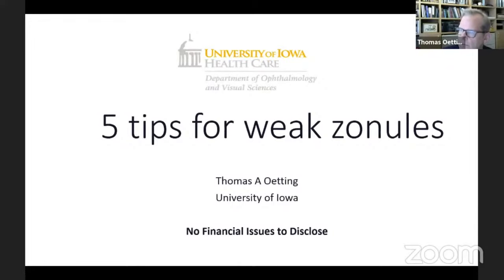I want to talk about weak zonules, and what I want to do is give some tips that might be useful to people of various levels. One of the great things about the courses in general that Arup puts on is he tends to give courses that have tips for people of all levels, and that's one of the things I really respect about his amazing career of education. And so that's what I want to try to do. I've just got five tips I want to focus on.